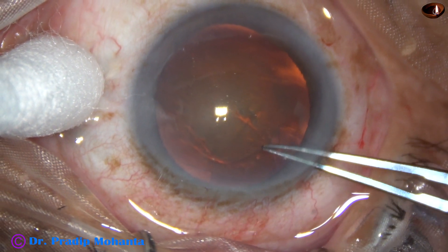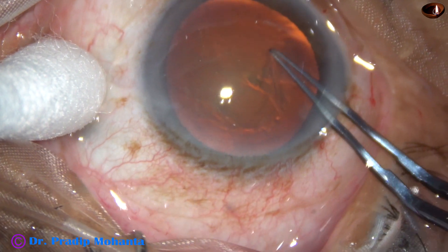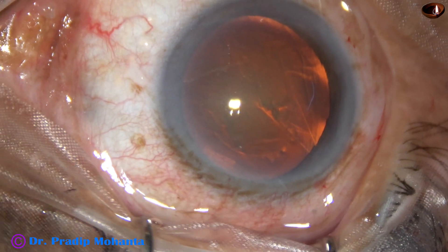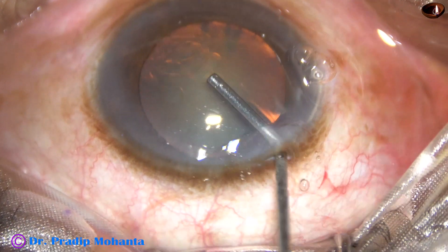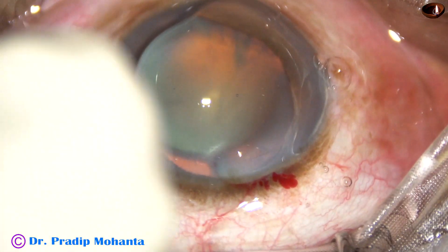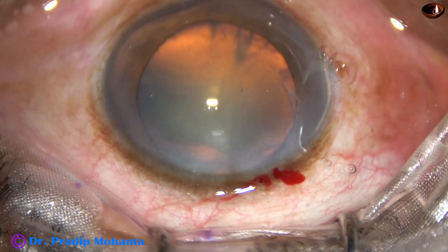This is in slow motion at about 75% speed. Now let us see if we can do this without using the needle, just by the rhexis forceps.